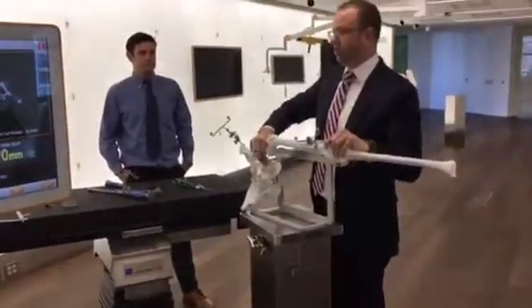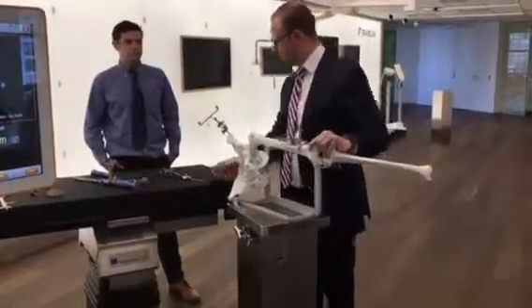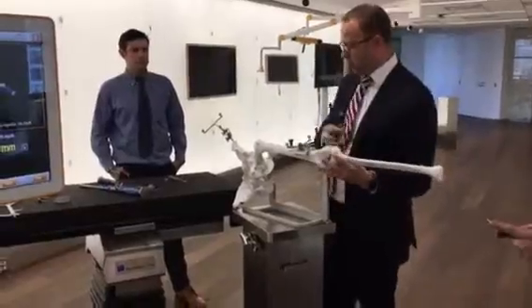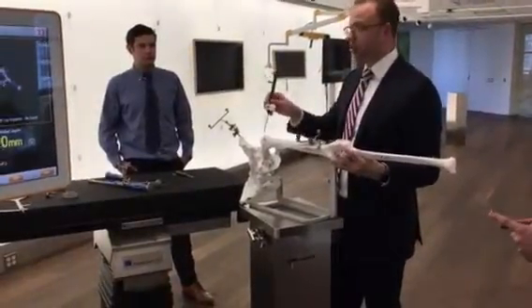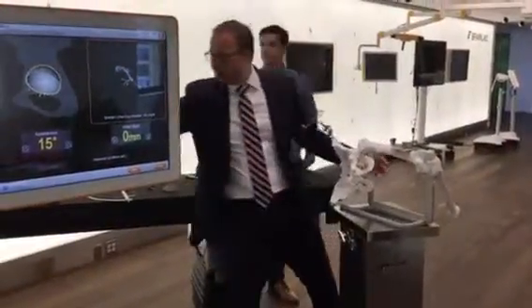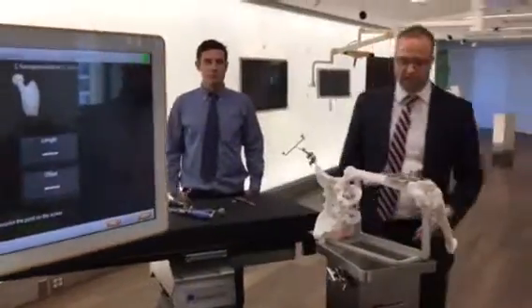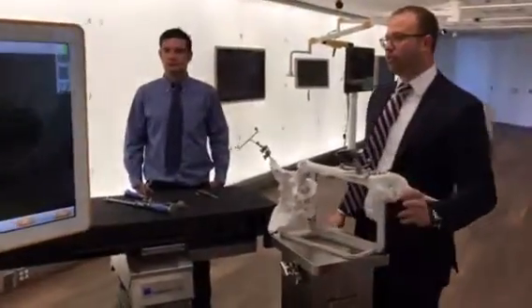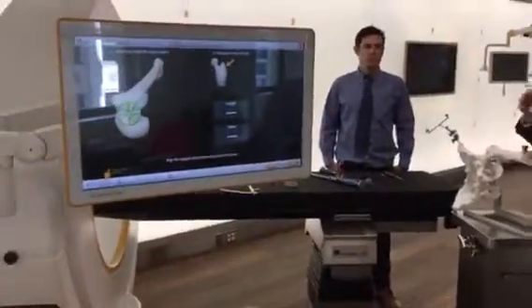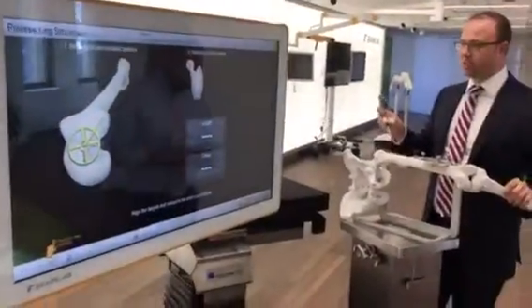As we place our provisional implants in, we can check the reduction, and with the reduction done, we can see how those provisional implants have affected the leg length. I'm not gonna change the leg length here. I'm gonna go back to my screw, and if I just press next on the computer, it will take me to the leg length portion. Perfect. The software is gonna ask me to restore the leg to its initial situation or its position, because we wanna make sure that the measurement we take is based on the same measurement and the same leg position at the start of the case.